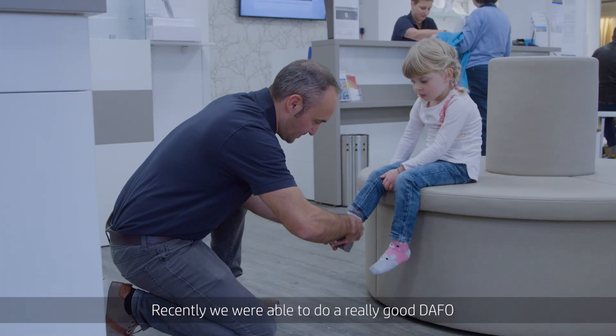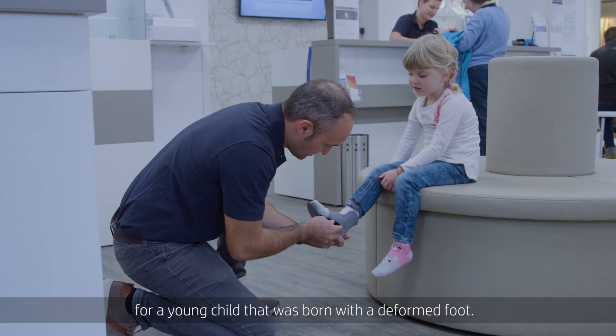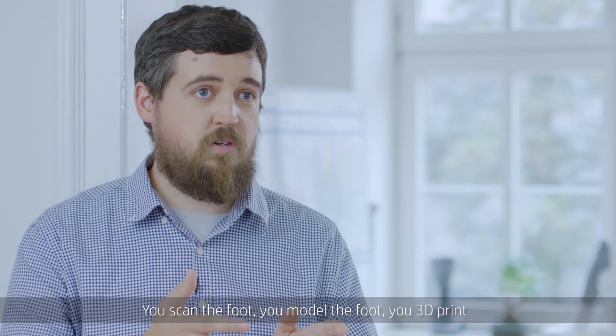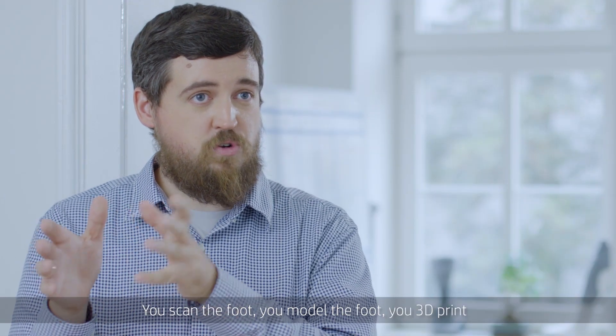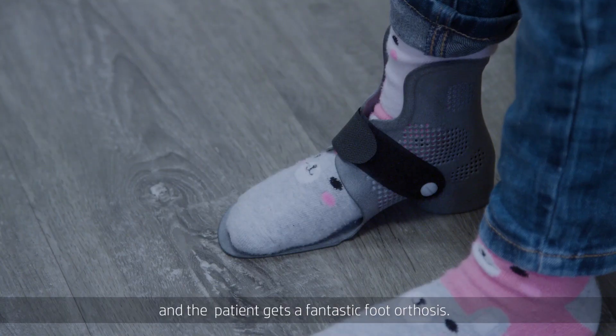Recently, we were able to do a really good DAFO for a young child. She was born with a deformed foot. You scan the foot, you model the foot, you 3D print, and the patient gets a fantastic foot orthosis.